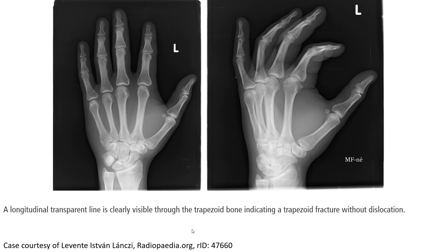As we see here in this image, in the AP and oblique views, you can see clearly a line across the trapezoid. The trapezoid is more appreciated from the oblique view.